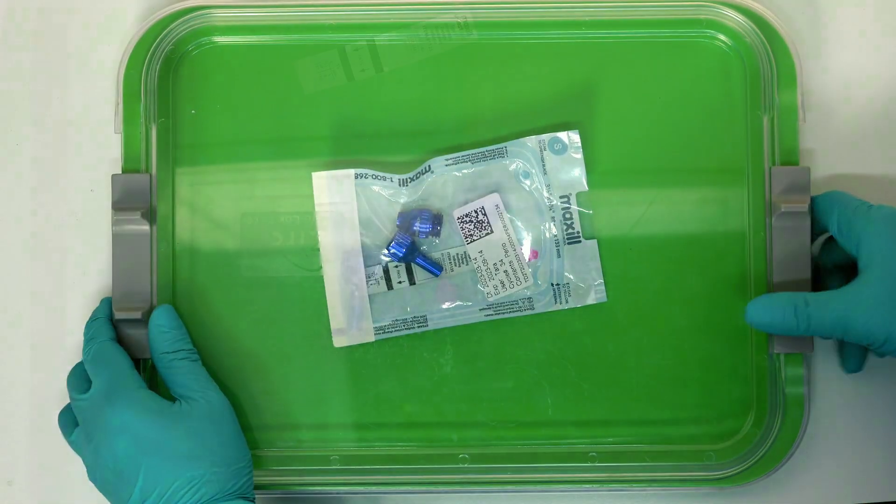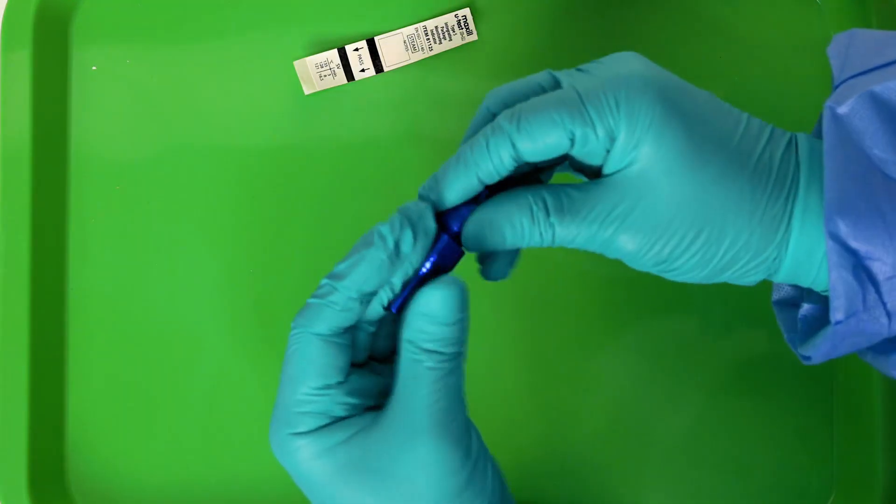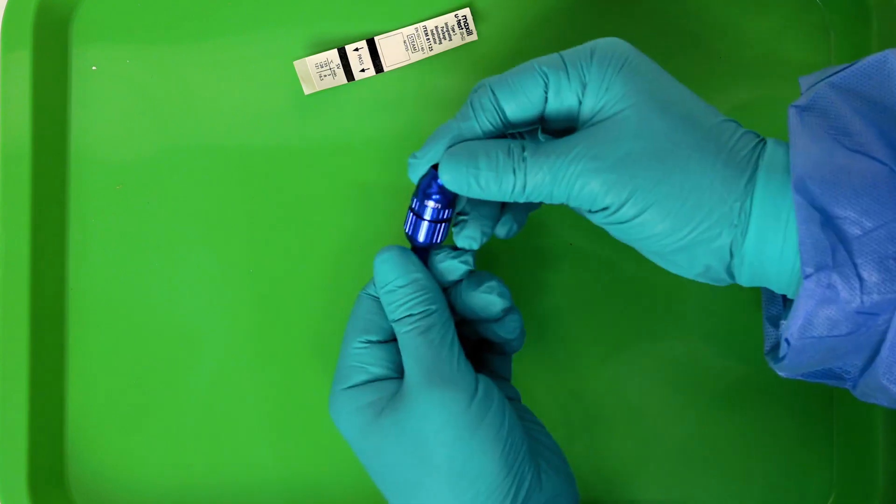Then, after sterilizing, reposition the diaphragm and reassemble all three parts. That's it! The valve is now sterilized and ready to be used again.